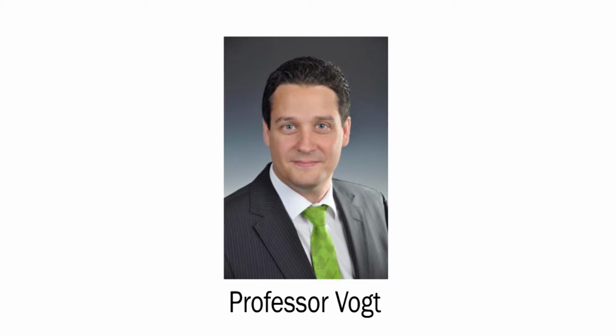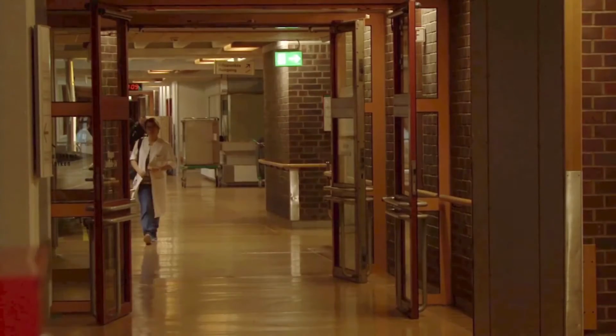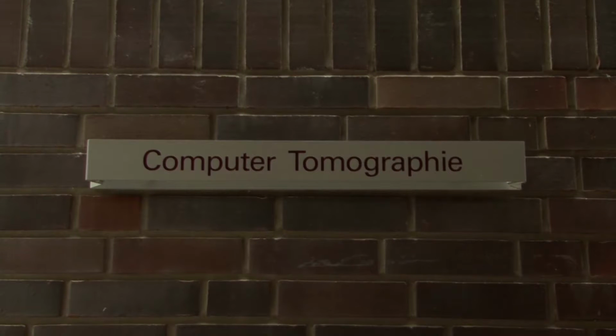One of the first doctors to use the MedTab in a clinical setting was Professor Vogt, head of medical imaging in the UKSH Lübeck, the third largest university hospital in Germany. We met the professor in his department. He took a few minutes out of his busy schedule to speak to us.